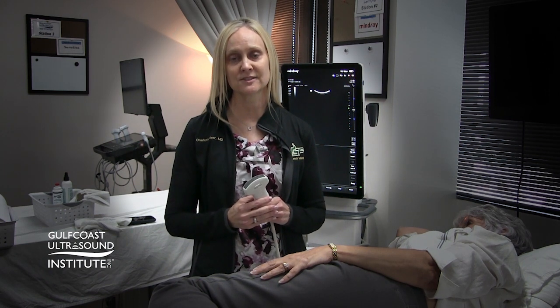Hi, I'm Dr. Charlotte Durr, here to provide you a hot tip of the day when ultrasounding the gastric antrum. We need to know how to assess the gastric antrum in patients preparing for procedural sedation. We have patients coming in on GLP-1 agonists, also known as Ozempic and Wegovy, who have delayed gastric emptying.